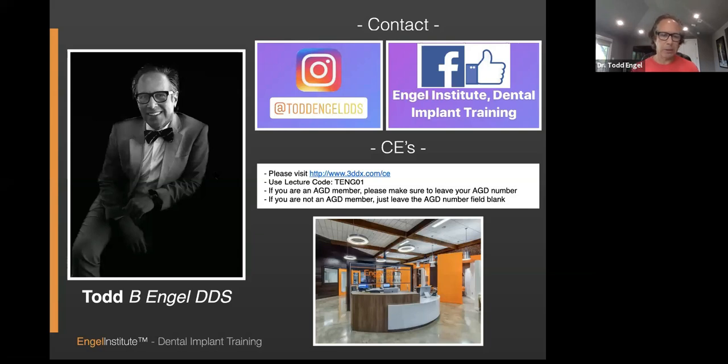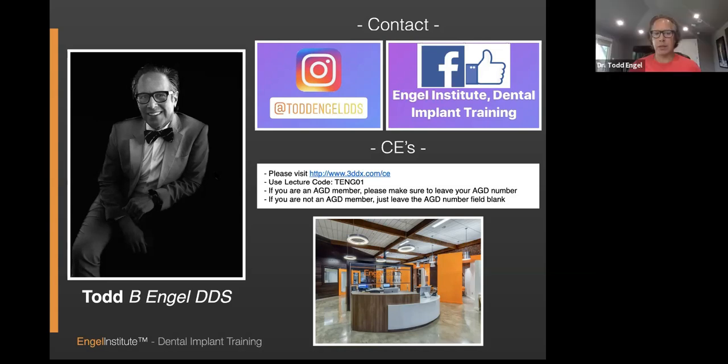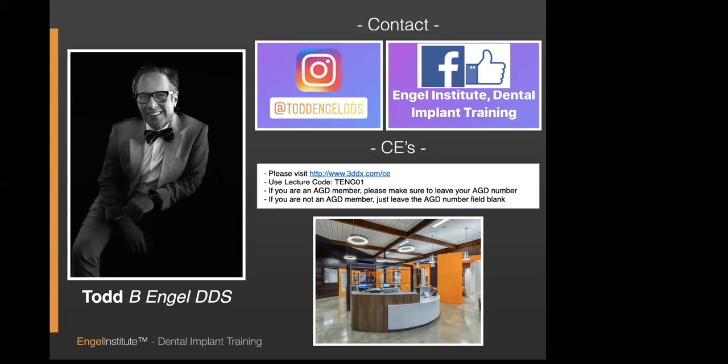Thank you. Frank, question? Thank you, Dr. Engel. Two people were asking the same question, one regarding the failed case, the one with the implant ending up in the palatal bone. Can you hear me? Yes, I can. Basically, the question is, how often do you end up taking cone beam CT during or after any implant surgery?